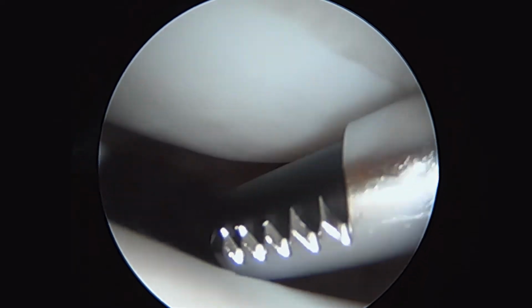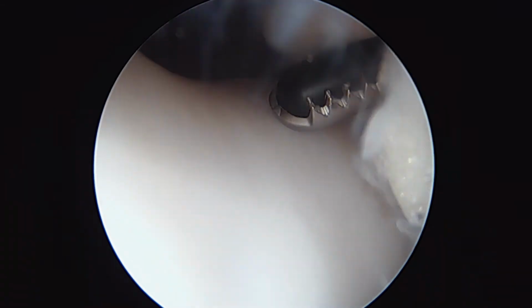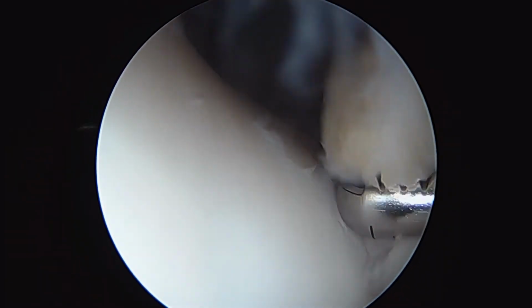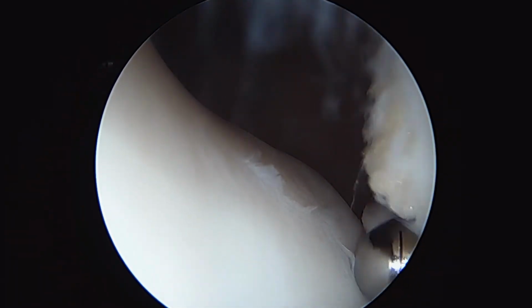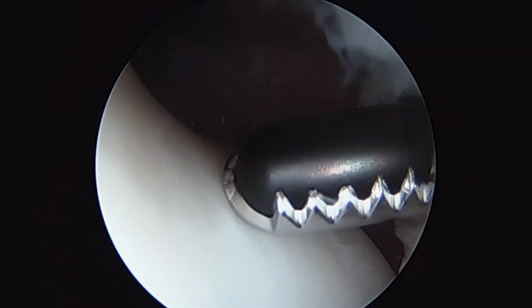Roll the leg over so its knee's pointing straight up. Great. That looks good. Here's the trochlea that the patella glides in. We can follow this all the way down the front of the knee here. That looks good. So far things are checking out pretty good here, and the rest of the knee.